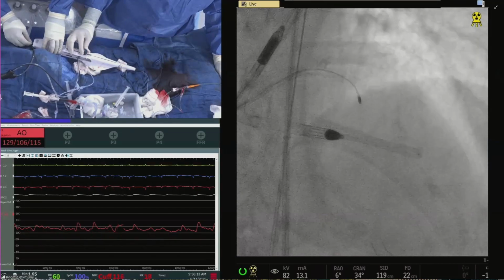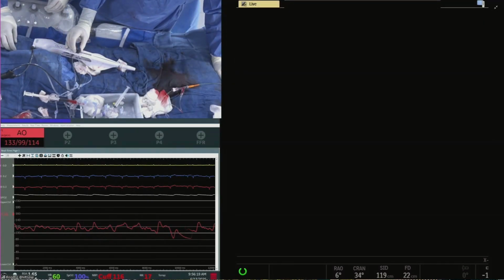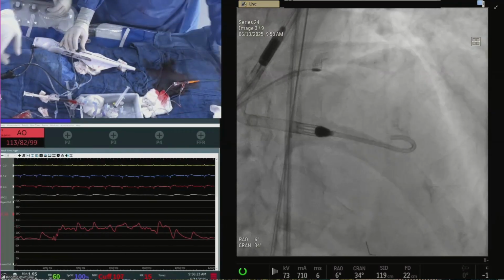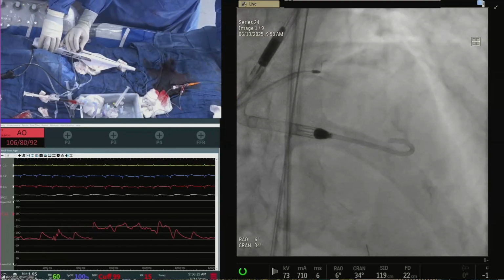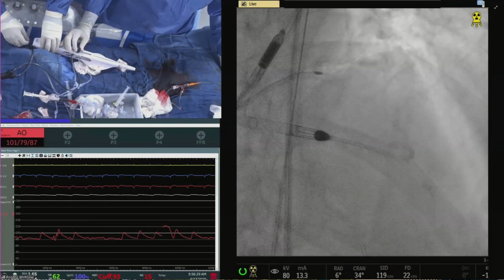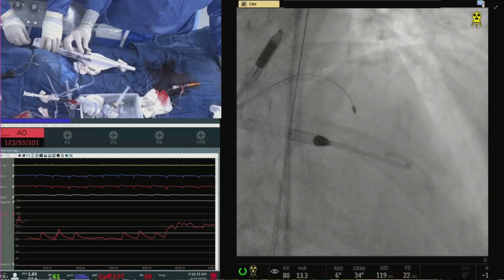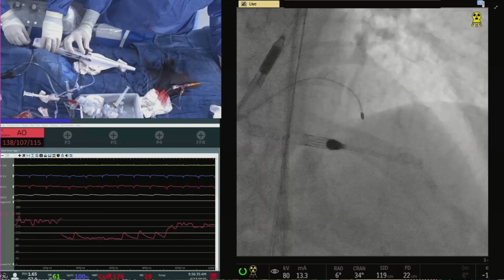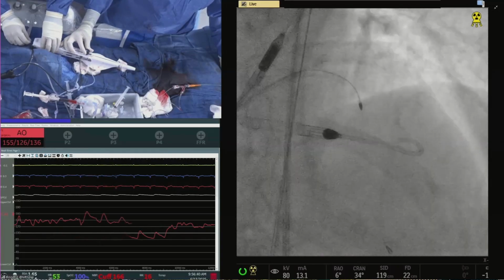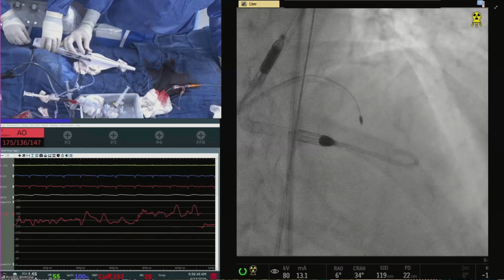Okay, you're making progress. And what's your speed there? Is it 170? 155 now, going up to 160. With the 1.25 in particular, you can see the hemodynamics as we are doing it. A little bit of EKG changes we are beginning to see. There you go. With that 1.25 in particular, you've got to go so slow and be careful not to get it stuck.